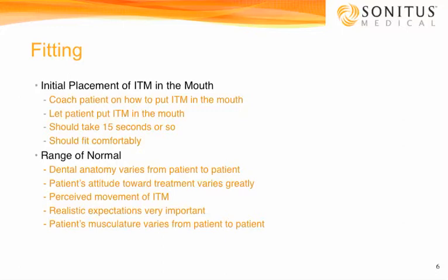If a patient opens really, really wide and they hit the actuator a little bit with a part of the jaw called the coronoid process, well, they don't have the patient open that wide. This does have to fit in the normal anatomical positions inside the mouth, and if a patient moves the muscles a lot, they will feel it and possibly dislodge it.